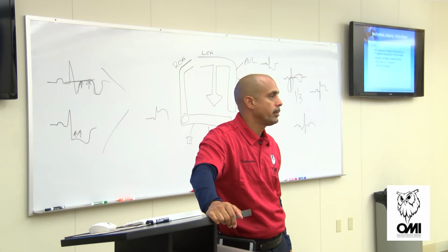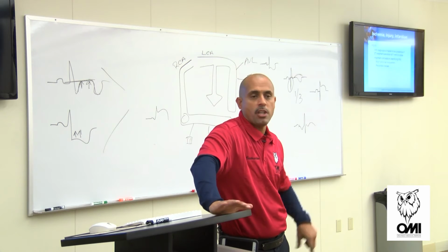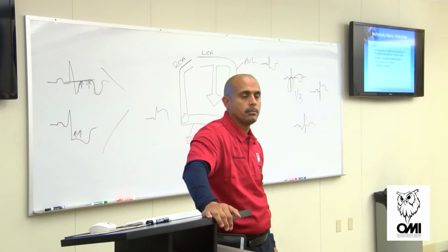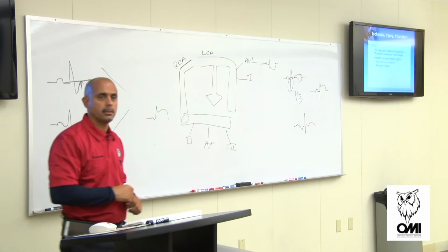Everybody with me? So maybe what you're saying is, if it's just depression, no elevation, that could be ischemia. Yeah. If there's elevation and you also see depression, it's just reciprocal. You with me? You got it.